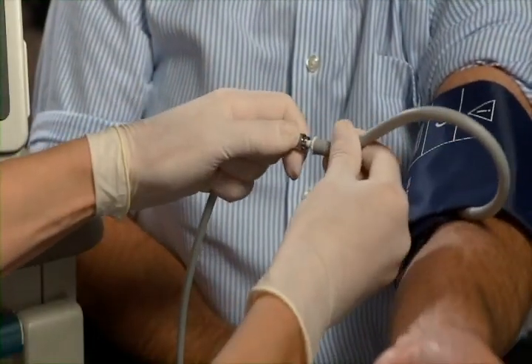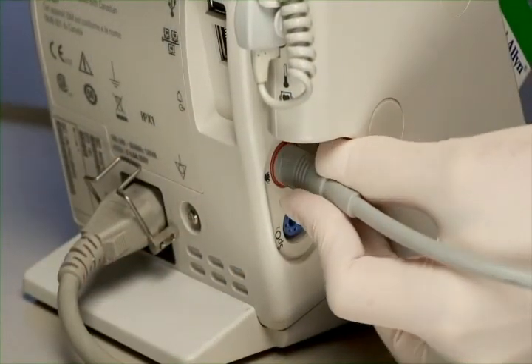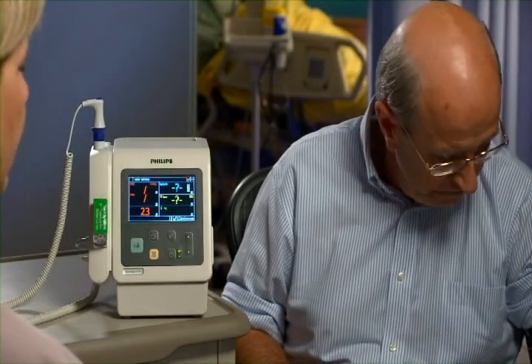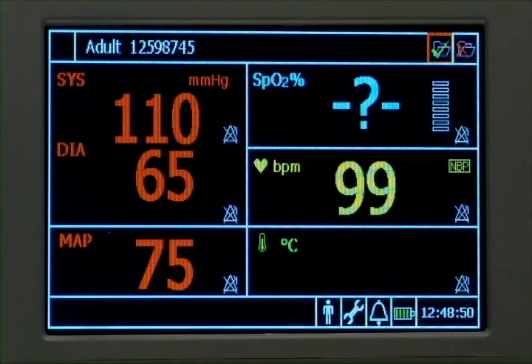Connect the cuff to the tubing and the tubing to the device. Press the NBP key on the front of the VSI to initiate a blood pressure measurement. Following deflation, the NBP measurement is displayed on the screen including systolic, diastolic, and mean arterial pressure.